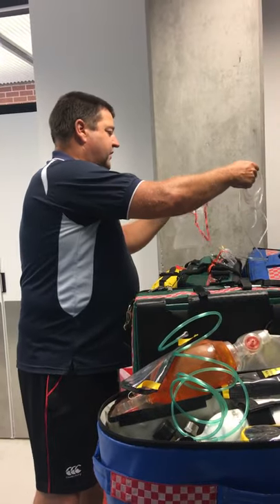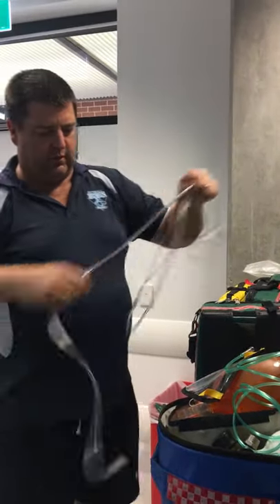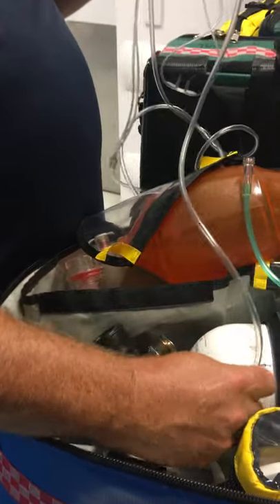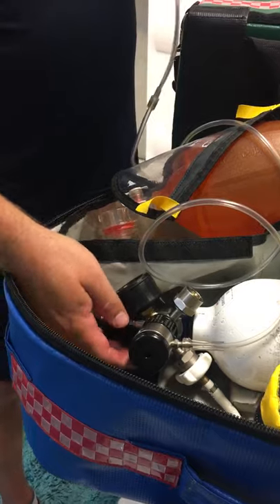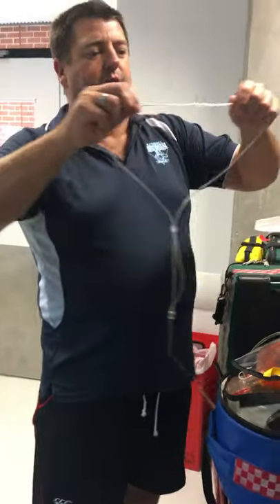Here are some nasal prongs. Sit that onto there. Run these generally speaking at 2 to 4 liters a minute. Your slides say you can put it at 6 liters a minute, but you'll find that running at 6 liters a minute you might blow someone's snot out their ears. It simply goes into the nostrils, goes over the ears, and gets tied up.